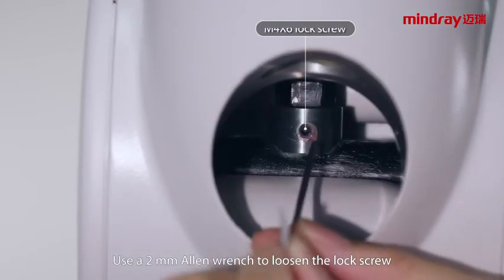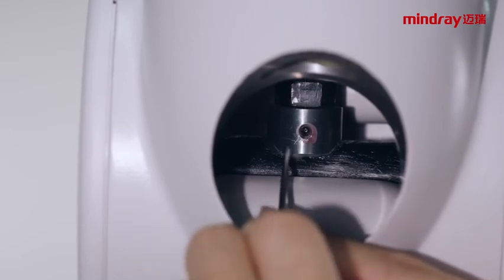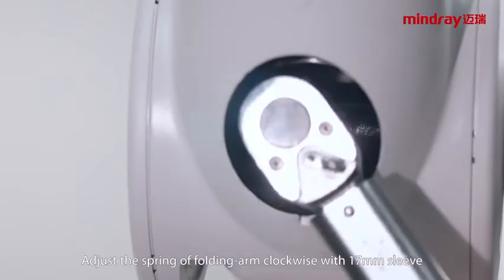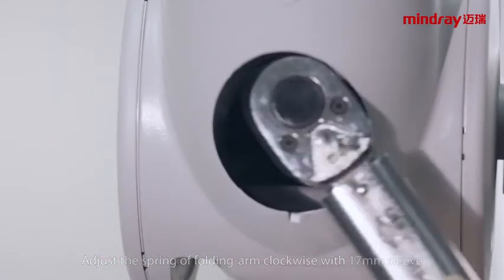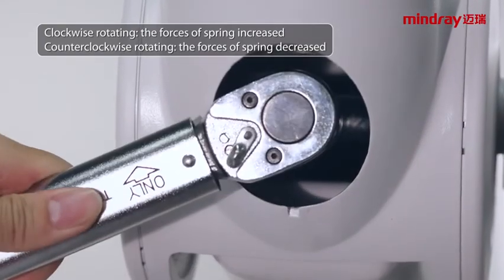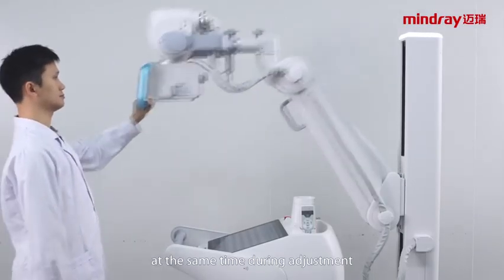Use a 2mm Allen wrench to loosen the lock screw. Then expand the folding arm to the horizontal state. Adjust the spring of the folding arm clockwise with a 17mm sleeve. Clockwise rotation increases the spring force; counterclockwise rotation decreases the spring force. The folding arm can be operated at the same time during adjustment.